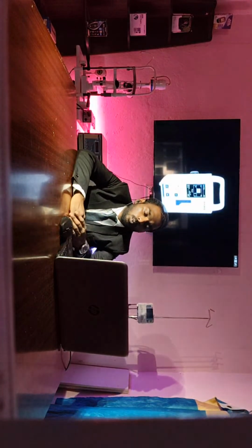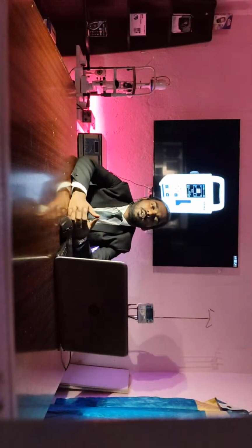Next, what is this equipment? This is called the infusion pump. During the introduction, I gave you an idea of what a drug delivery system is. The drug delivery system is the way you administer the drug into the patient's body. For example, in the oral drug delivery system, we take a tablet or a tonic.